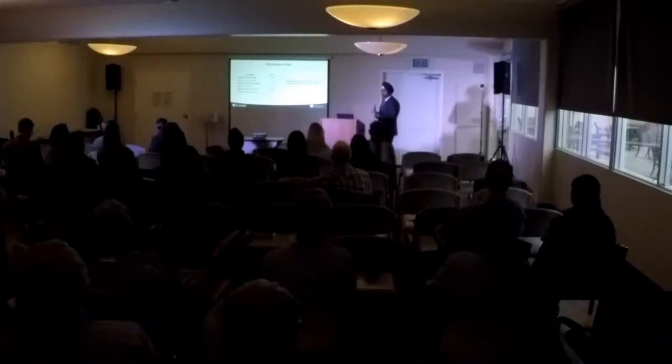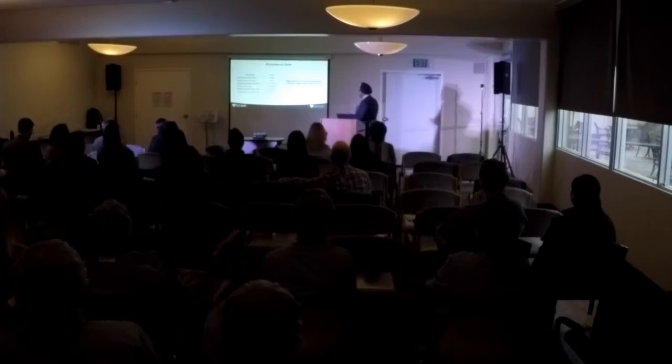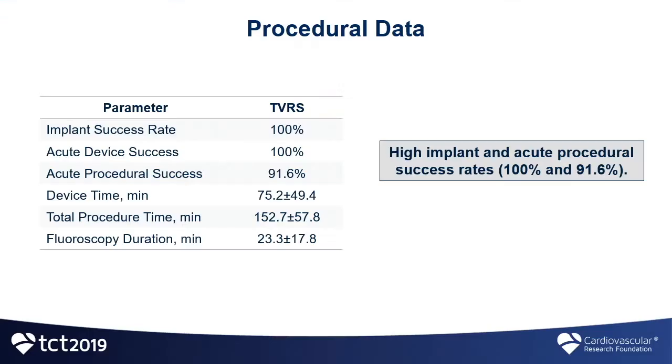This was the take-home message that we actually learned from the mitral trials, and it's the same thing with the tricuspid trials. This therapy is an ultra-safe procedure. If you look at success rates of implantation, success rates of the device being put in there, it's 100%. Unlike TAVR, there's no hemodynamic shifts. There's no need to have perfusion in the room. There's no need to have all this personnel in the room. There's no rapid pacing. There's no major hemodynamic swings. Patients don't need A-lines. They don't need pressors.